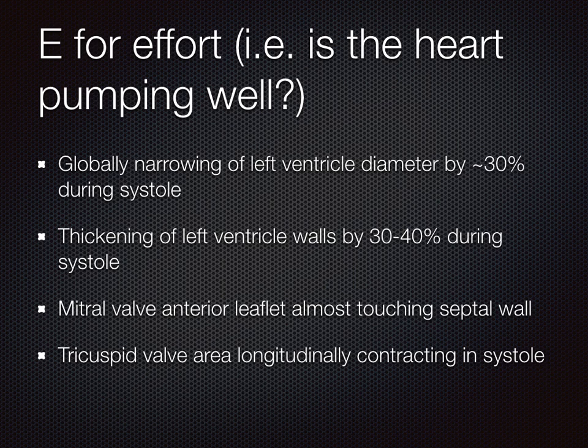The other thing is that we know that good blood flow through the heart results in the mitral valve anterior leaflet being flipped up and almost touching the septal wall. So is this happening or not?